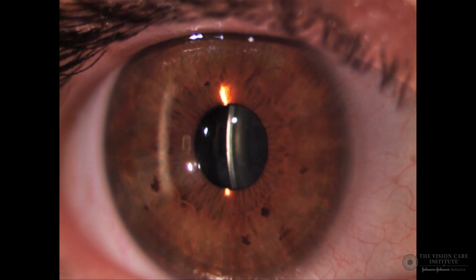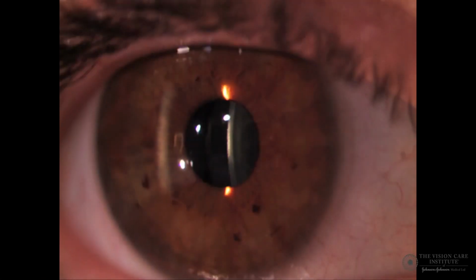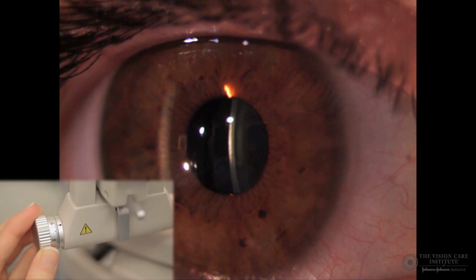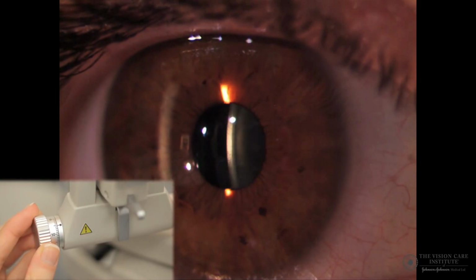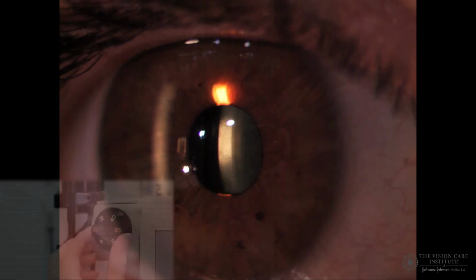Once this is done, we can reduce the brightness of the slit lamp and we can widen the slit further so that we can see a large area of the anterior surface of the lens. This can be further magnified if required, and then the surface can be scanned to examine for any deposition or other disease processes.